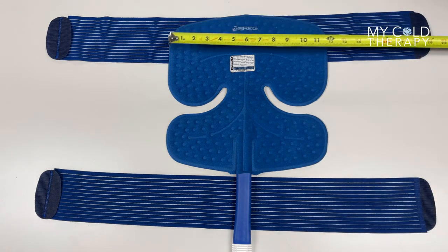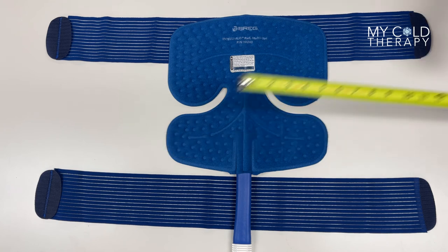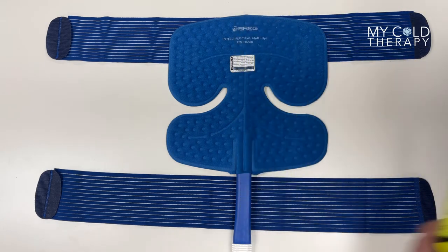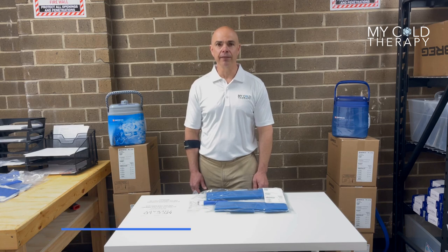The pad is 13 inches long on the top, 13 inches long on the bottom, and it's also 13 inches high. Thank you for following along with our video today. For further information please go to MyColdTherapy.com or give us a call between the hours of 9 a.m. and 4 p.m. Eastern Time at 704-953-2545. Thank you.